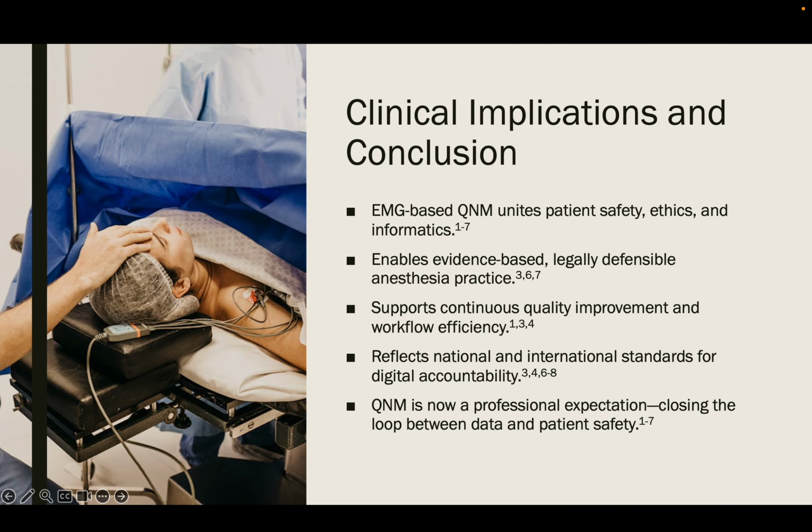To bring it all together, quantitative neuromuscular monitoring has evolved from an optional technology into a professional and ethical standard in anesthesia care. EMG based systems integrate objective physiological data directly into the patient's electronic record, creating a measurable improvement in safety, accountability, and workflow efficiency. This integration supports evidence based, legally defensible practice while aligning with regulatory frameworks from the ASA, FDA, and HIPAA.